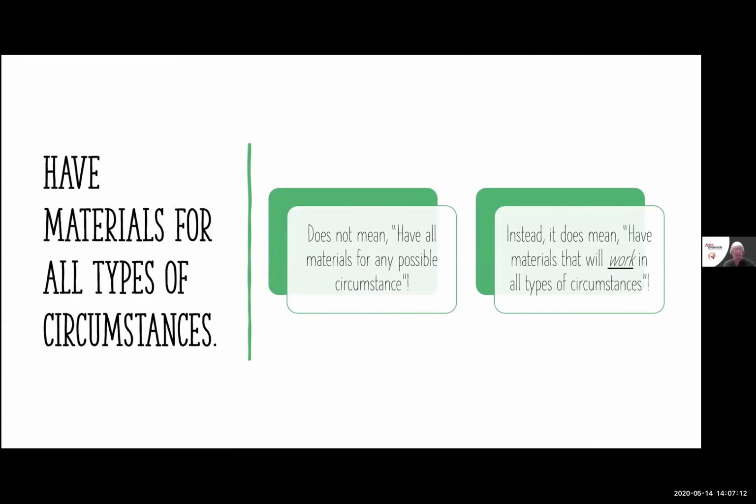Now, we need to also have the proper amount of materials and the correct type of materials that's there. And by that, I am not saying that you need to buy everything from every vendor that is possible out there that you can use to grow bone with. That is not what I'm talking about. But instead, the same materials that I use in my socket preservation, I use for my horizontal bone growth.